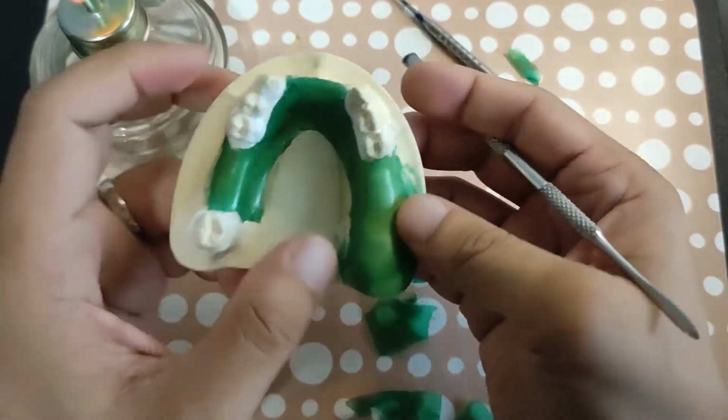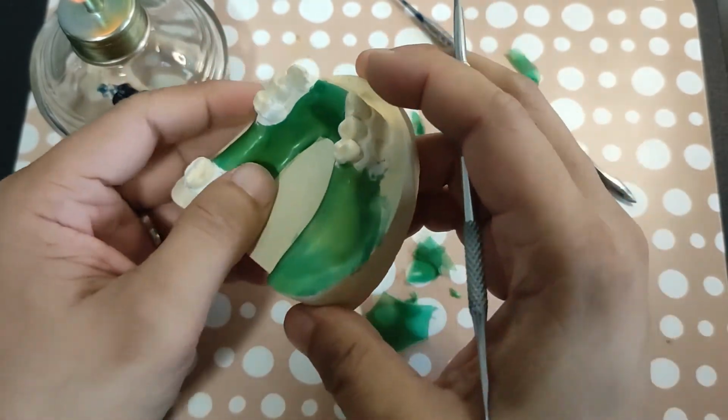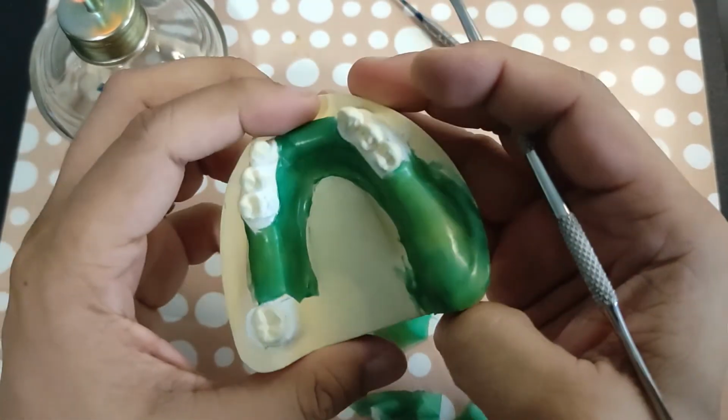Alright. So it doesn't necessarily have to follow a form or the form of your major connector.